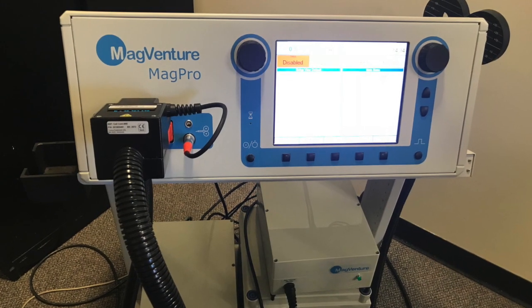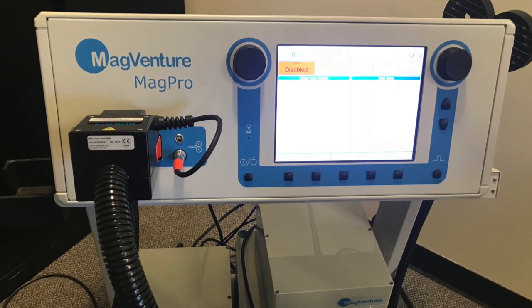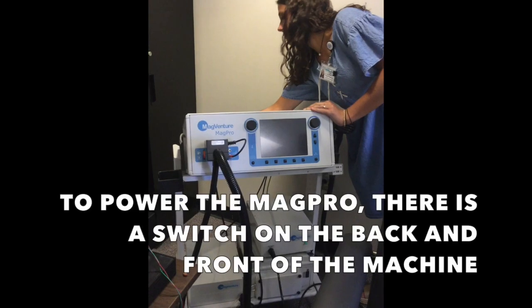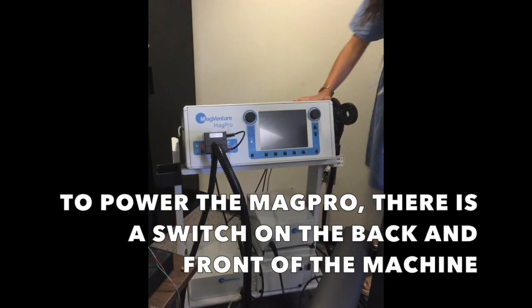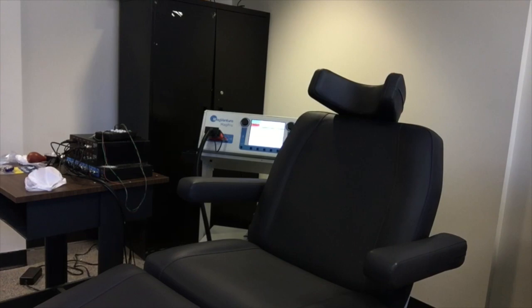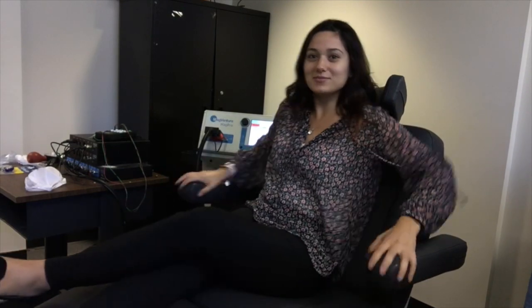It's important to first familiarize yourself with the MagVenture MagPro. To power the machine, there's a switch in both the back and the front of the machine. While you wait for the machine to warm up, you can bring your participant in, have them take a seat and get as comfortable as possible.